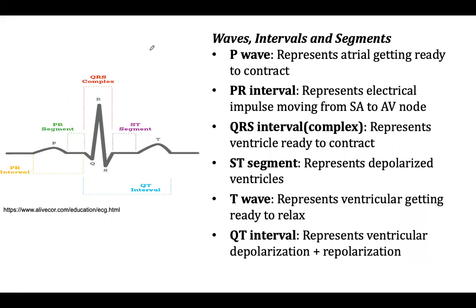Now you will get quite a few of them depending on the heartbeat. So if a person has a heartbeat of about 70 beats per minute, if you look at your strip, these ECG patterns are spread out a little bit. But if the person's heart rate is higher, then these patterns will be closer together. Again, think about it logically. The higher your heartbeat is, the more of these electrical impulses will be created, and therefore they will appear closer to each other.